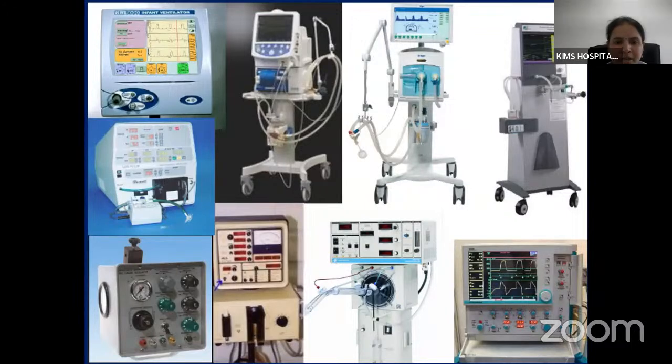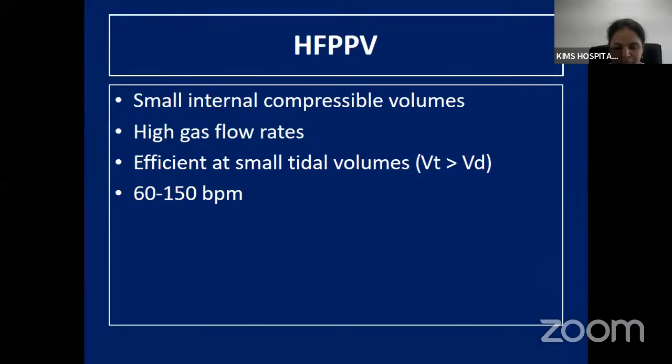There are multiple devices now that help us to use high frequency ventilation in clinical use. This ranges from regular hybrid ventilators such as the SLE 6000 or the Draeger ventilator, which help us to achieve both conventional ventilation as well as high frequency ventilation, whereas we have some exclusive high frequency oscillators like the SensorMedics oscillator, which deliver only high frequency ventilation.